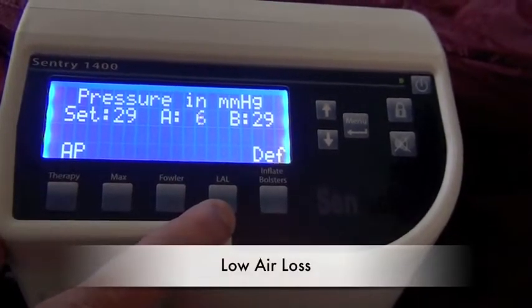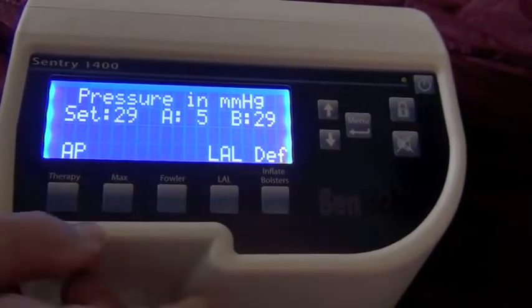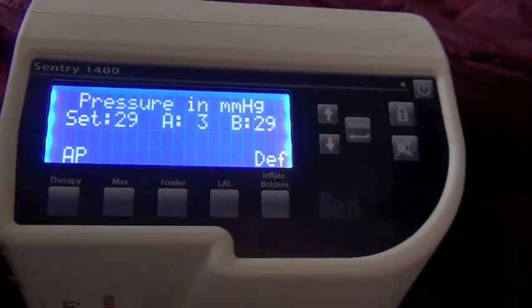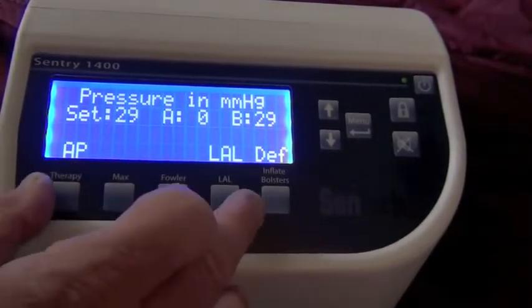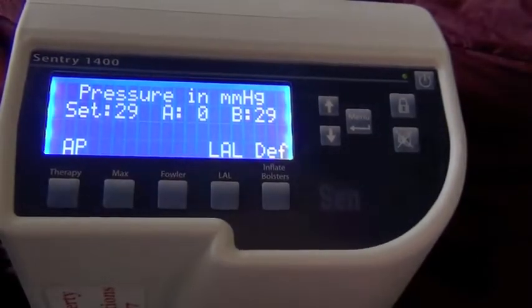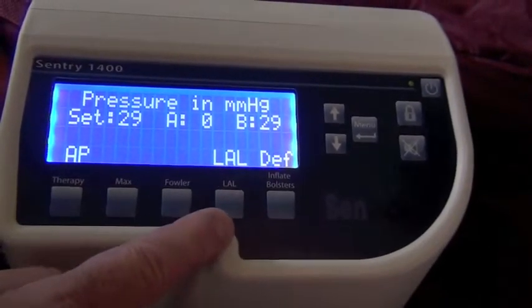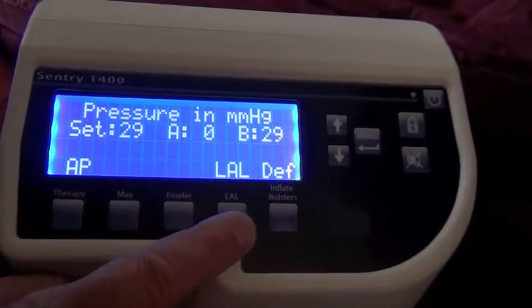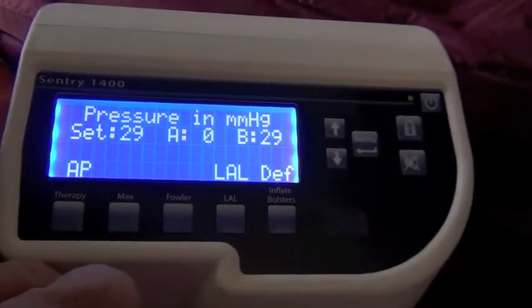The next button is the low air loss feature. And what's interesting about this system is you have the opportunity, as you do with the alternating pressure over here, to choose whether or not you want a low air loss. And what's interesting about this is the low air loss and the alternating pressure are completely independent systems on the Sentry 1400. Low air loss therapy, again, if you go back to your Braden and moisture is an issue, you definitely want to consider using the low air loss feature on the Sentry 1400.